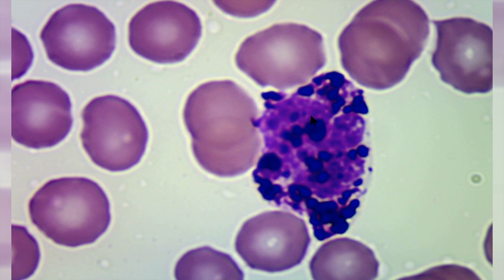And on the other side of the spectrum, you can see basophils in which, during the process of fixation and slide preparation, some of these granules wash out, and the basophil is left without many granules. Occasionally you can see a large dark granule in the corner of the cell.